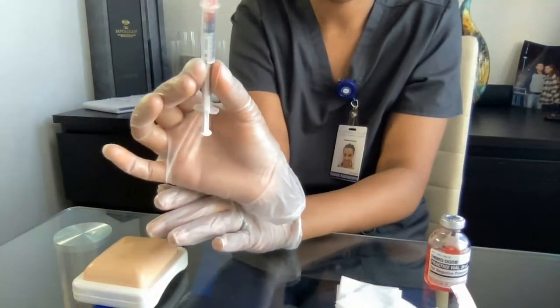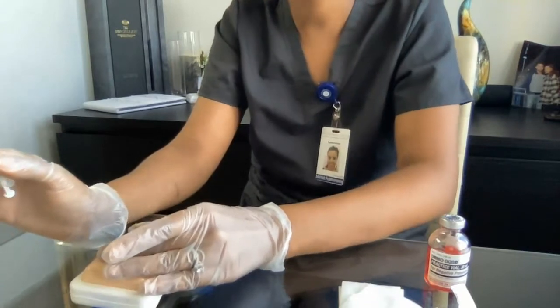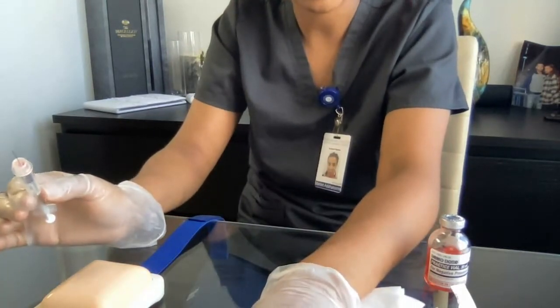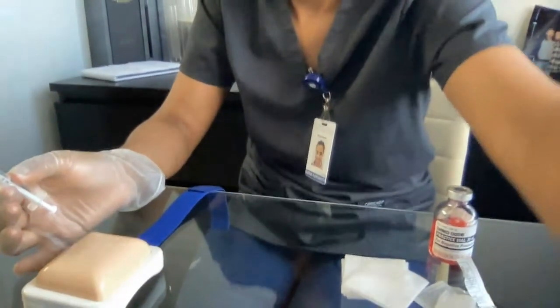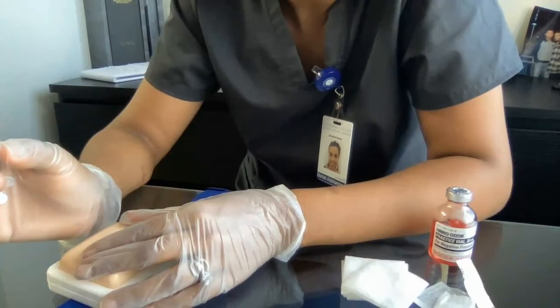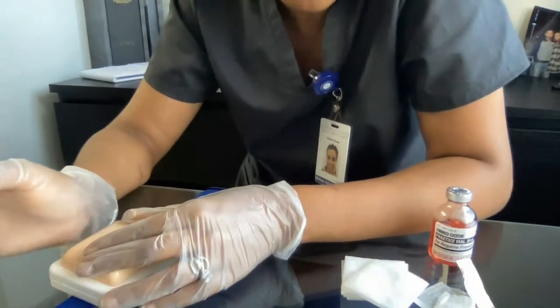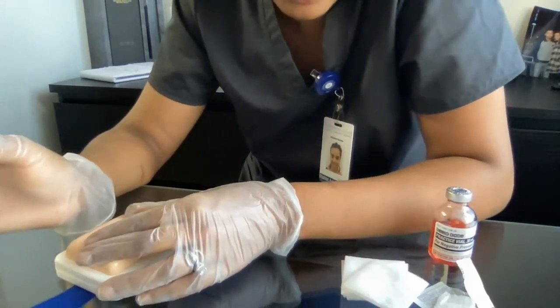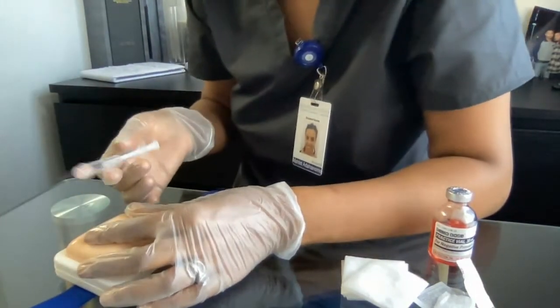With my other hand I'm going to stretch the skin over the site using my forefinger and thumb. I'll insert the needle at a 5 to 15 degree angle to ensure resistance is felt. The aim is to get a small bleb approximately 6 to 10 millimeters, so I'm going to go ahead and inject.